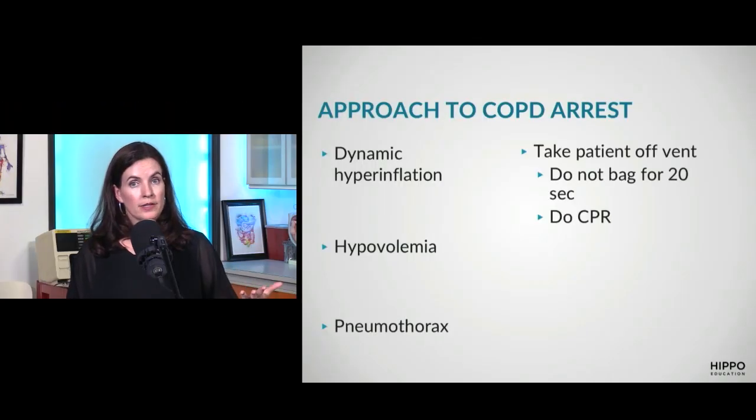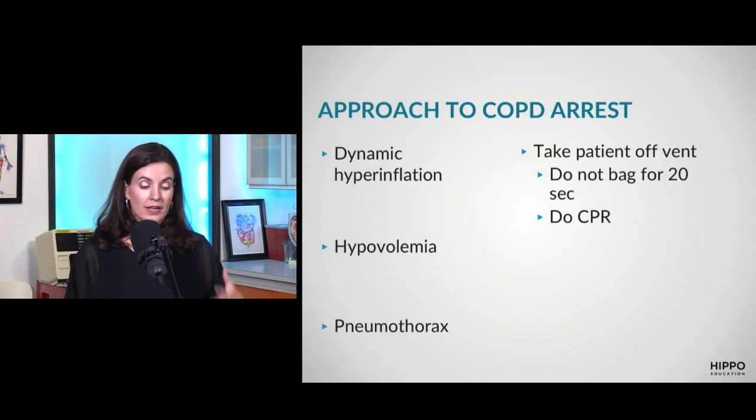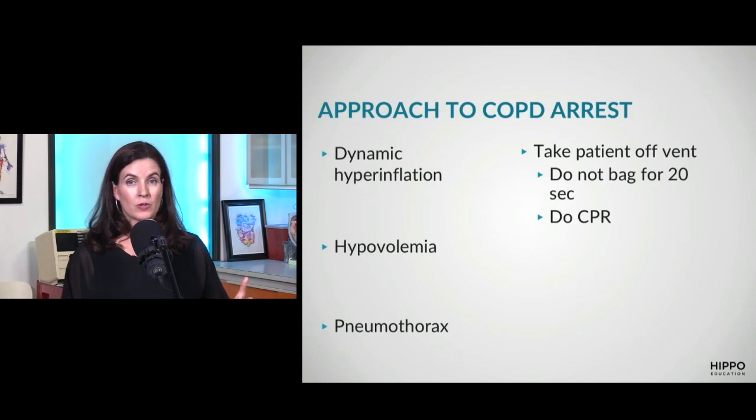Awesome. So when you're starting to manage this arrest, as we mentioned, we're going to take these patients off the ventilator, but then I will not bag them for 20 seconds. And this will feel like the longest 20 seconds of your life. I usually try to get somebody to look at the clock or set a little timer, because otherwise 2 seconds go by and I think it's been 20 and I start bagging again.